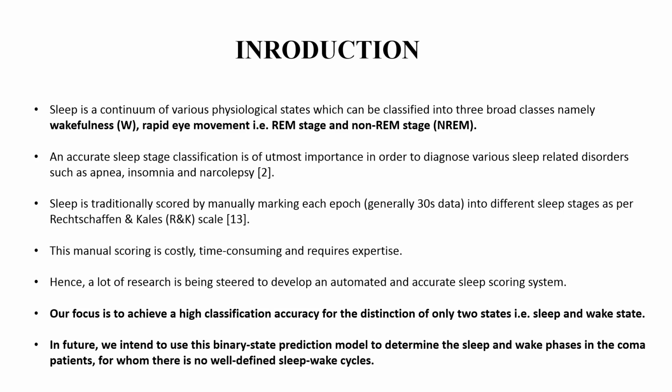In future, we would like to use this binary prediction model to determine the sleep or wake phases in coma patients, because there is no well-defined sleep-wake cycle for these patients. Hence, an accurate model that can predict these two states in coma patients is of utmost importance to the clinicians.